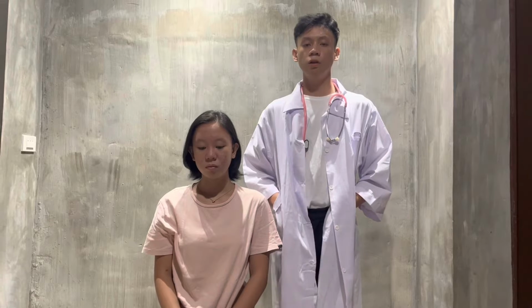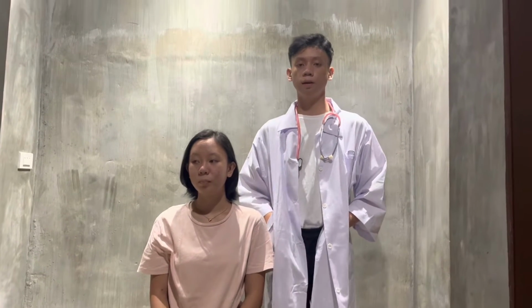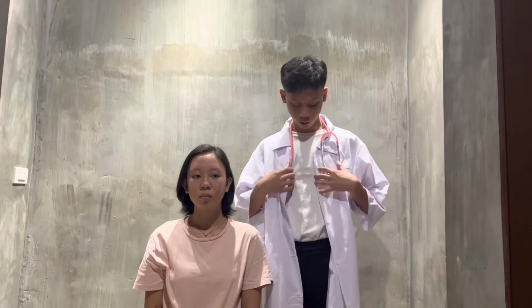Good day everyone, my name is Juan Miguel Apat, and today I'm going to perform a cardiovascular system assessment. For the equipment, we're going to use a stethoscope.